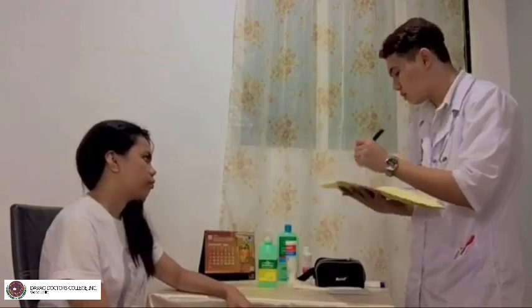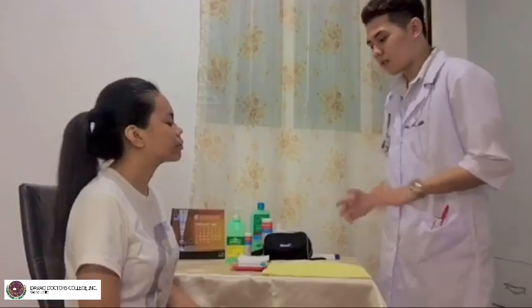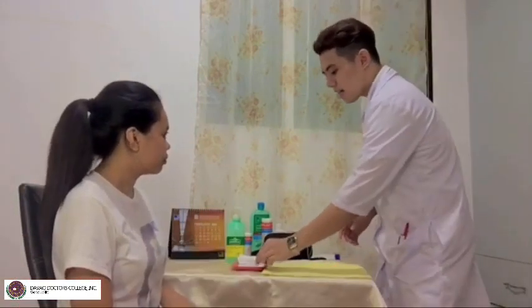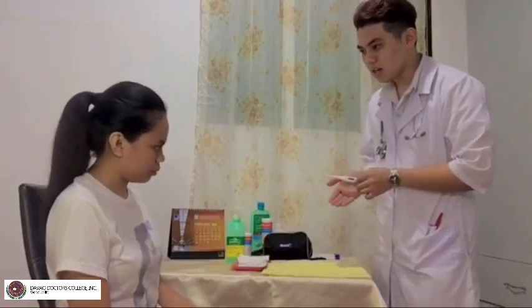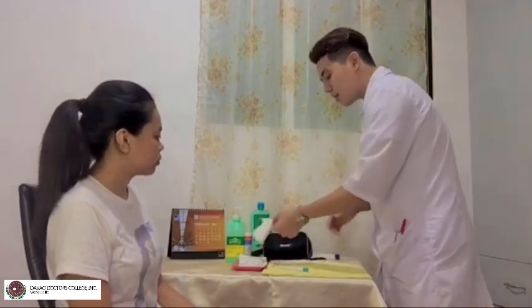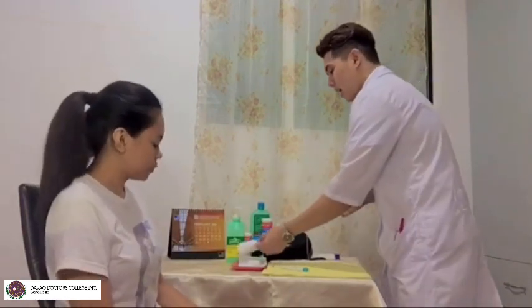Okay. So after this procedure, ma'am, this oral method, do you have any other questions? None so far. Okay, ma'am. So karon kay kuwaon na po nato imuhang temperature using the other method, which is the axillary method. So maggamit di ay ta karon og digital thermometer and ibutang na ko ni sa imong armpit tapos i-test na ko imuhang temperature and then limpyuhan po nato na using this paper towel. And before we proceed, ma'am, do you have any other questions? None so far po. Okay.